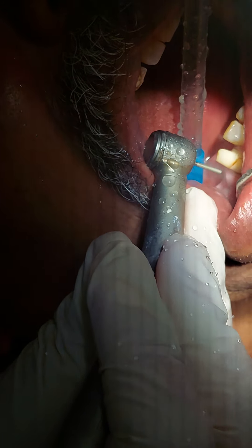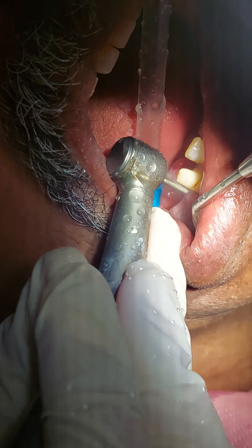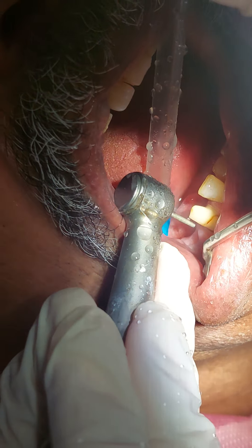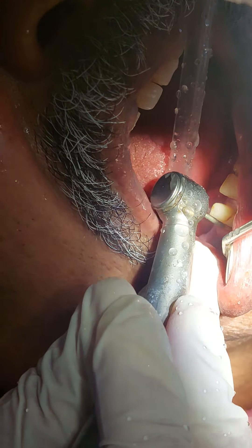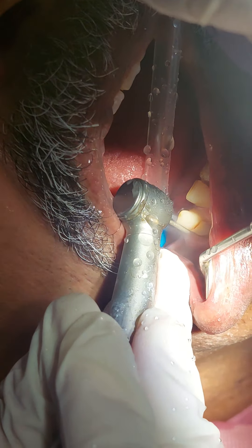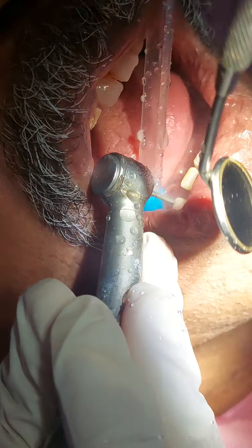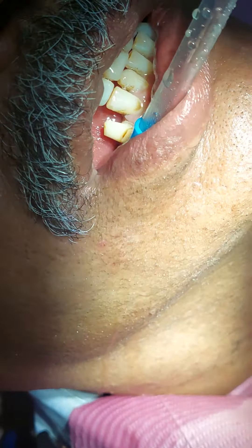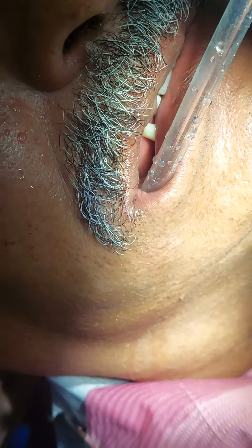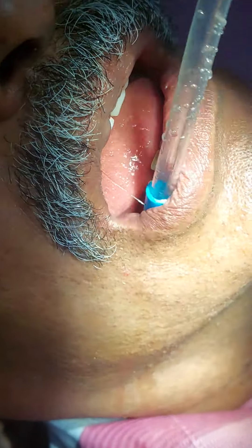I'm in the correct taper — not over taper, not under taper — because many times while working with undercuts you might feel like tilting away from the tooth, which will produce another undercut. No — I want to work with the correct taper towards the tooth and simply brush the surface of the tooth. The body of the bur is working to remove the undercut while I'm still in the correct taper. Now you are going to repeat the same procedure on the molar area — remove the undercut from the buccal of the molar. Make sure you don't interrupt the two planes' bulge, only removing the bulge immediately over the undercut that is present.